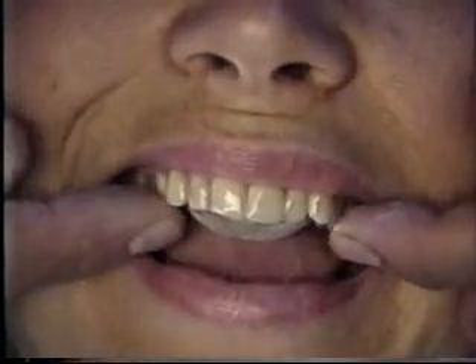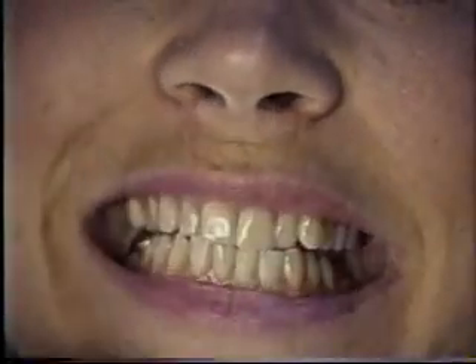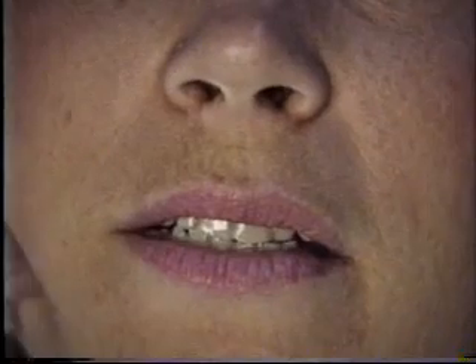You put your chin all the way down now? Oh yeah, I can do it first thing in the morning, even before I loosen up my neck. So eventually we talk about putting buildups on her teeth to give her a more permanent position, because she still takes the splint out to eat, which means the jaw can slide back. Although even with the splint out, she tends to hold her jaw forward. Well, thank you very much.